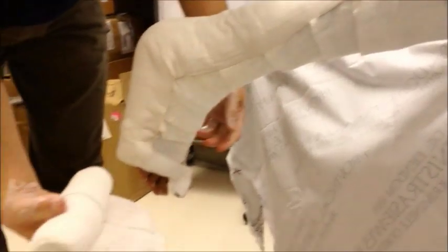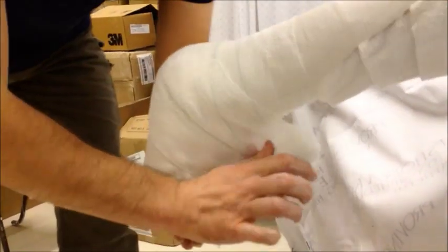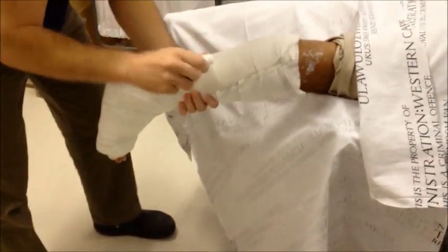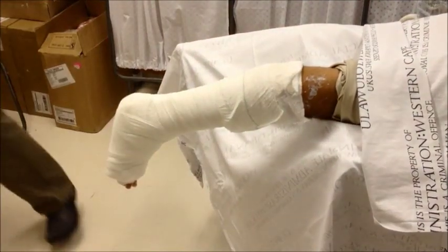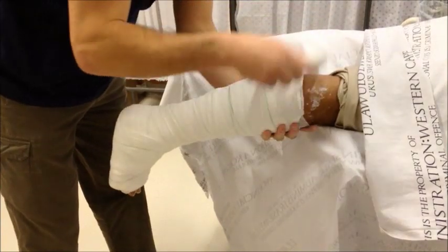Now we're going to put our final layer which is just to fix the whole thing together — we use a stretchy bandage. I like to start at the area of the injury, go to the toes and come back up. It's a relatively firm wind and again we're going to do a 50% overlay. At the end, go further than the end of the plaster — I'll show you why shortly. You may run out just before you've had enough — that's not a problem, just take a second roll. Get it nice and neat and wind slightly beyond where you need to be.